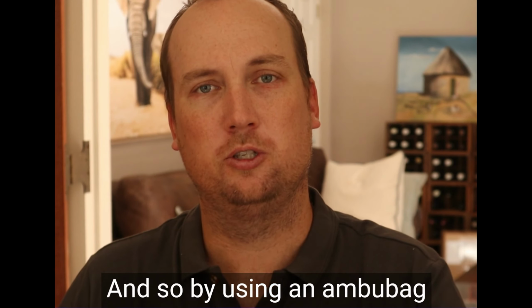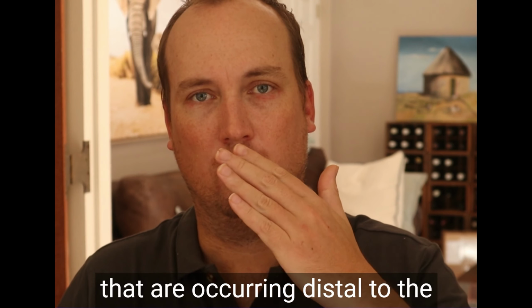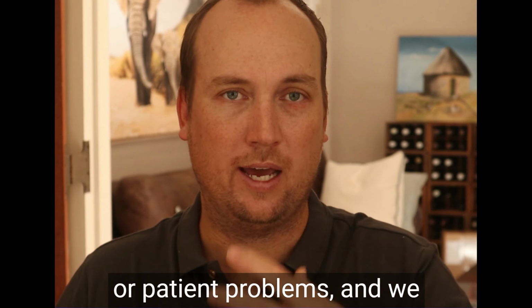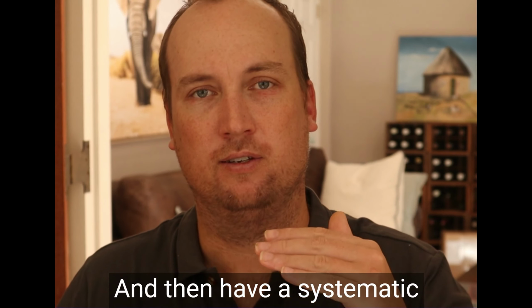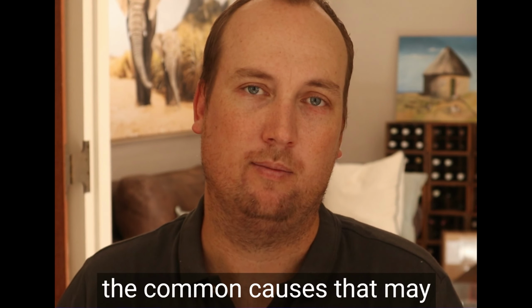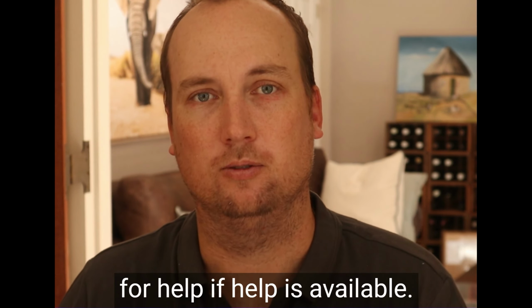And so by using an ambubag early on in the management of this situation, we can quite quickly separate out problems that are occurring distal to the endotracheal tube, so airway or patient problems, from ventilator or circuit problems, and then have a systematic way of assessing for each of the common causes that may be going on, not forgetting to alert your team to the problem that you're facing and calling for help if help is available.